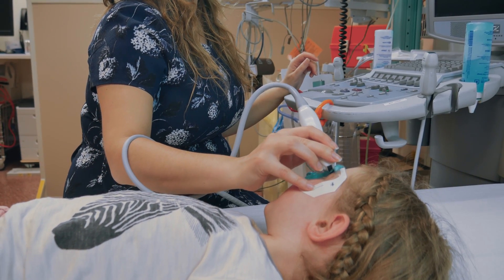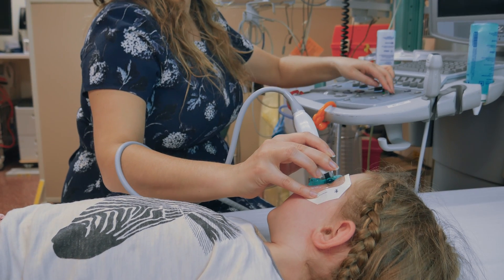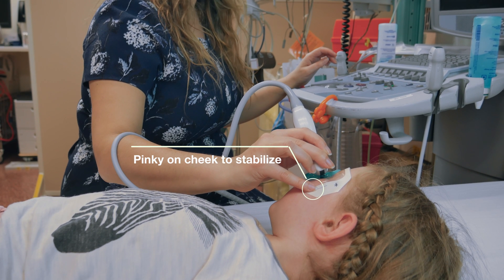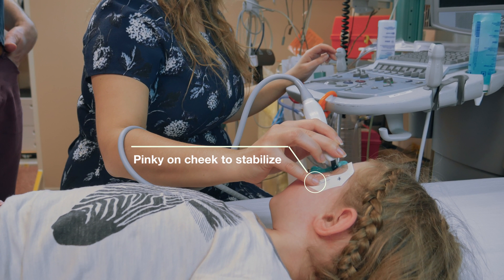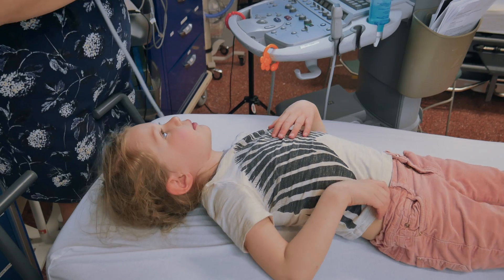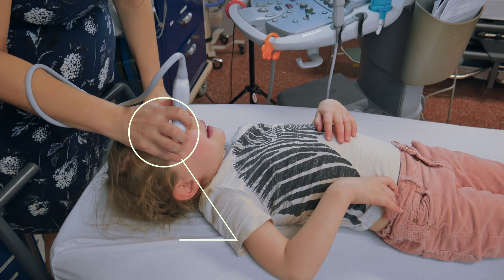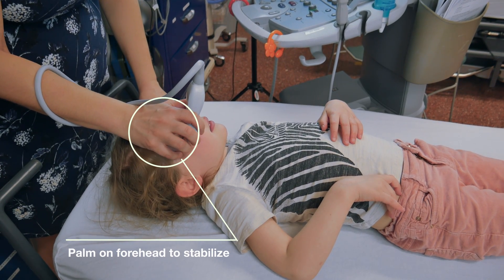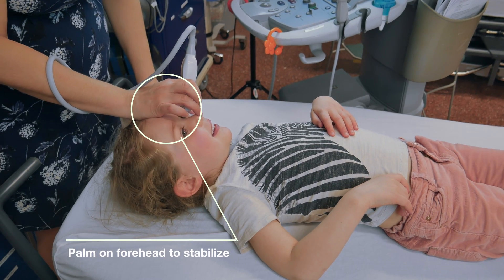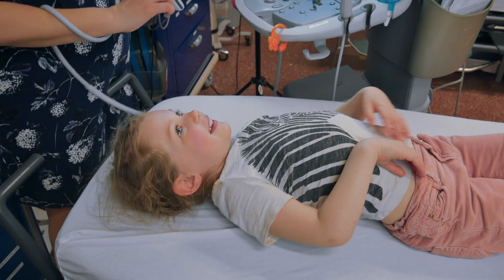As you can see in this video, the most common technique is to place the ultrasound machine to the patient's right, similar to medical physical exam convention. From this position, be sure to place your finger on the child's nose or cheek to stabilize your hand. Another option is to stand behind the patient. In this manner, you can place your palm or finger on the child's forehead for more stability if the child is moving a great deal. Either bring the height of the bed up or sit beside the bed so you're not leaning over or on the child.